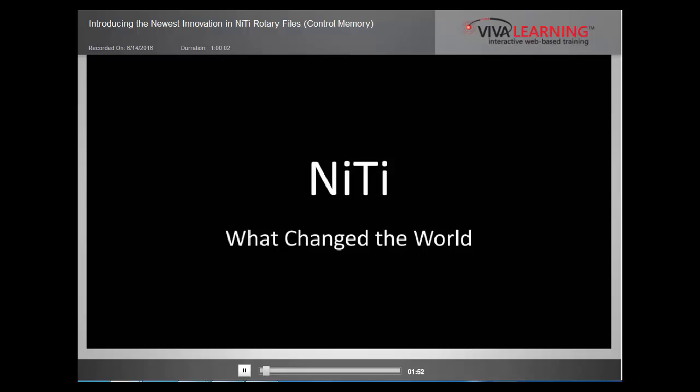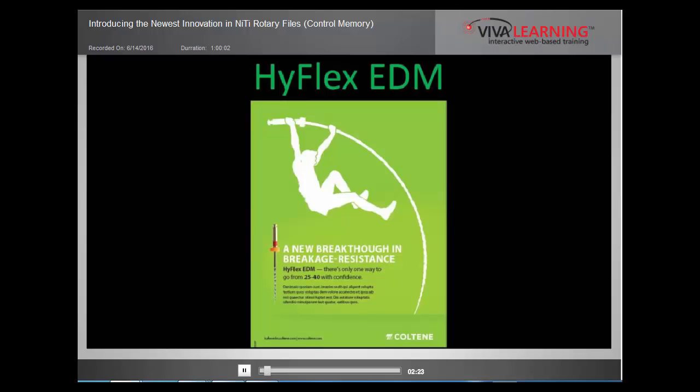We're going to begin the discussion with nickel titanium and how it changed the world of endodontics, and it truly did. For decades, folks were doing endodontics through hand instrumentation and Gates Glidden burs, and things of that nature. Cases were taking a long time. They were a little bit unpredictable. But rotary and nickel titanium files came along and really changed the way things were done.